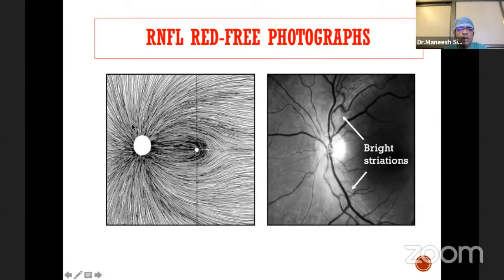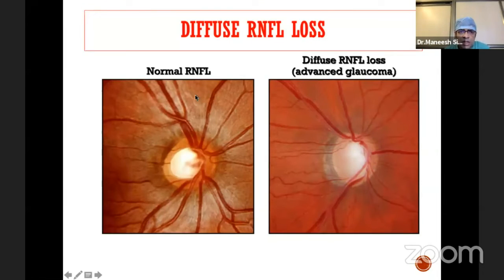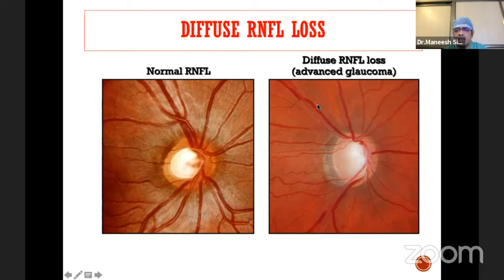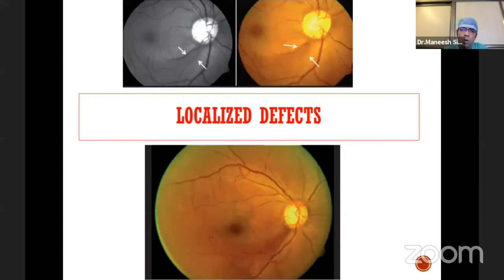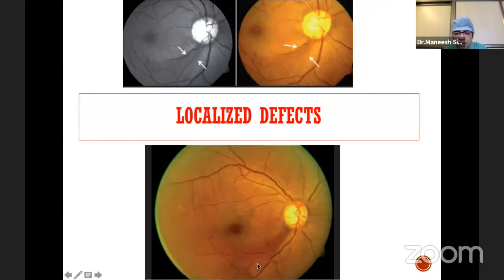This is a normal pattern showing how the retinal nerve fibers converge at the optic disc, with bright striations visible in a patient with a healthy retinal nerve fiber layer. In contrast, a patient with diffuse loss shows no striations, bare blood vessels, and a totally lusterless retina — indicating diffuse loss of retinal nerve fiber layer. More commonly seen is localized loss, especially in early glaucoma, where you need to find areas of localized RNFL loss. Wedge-like defects following the pattern of the retinal nerve fiber layer are often seen.